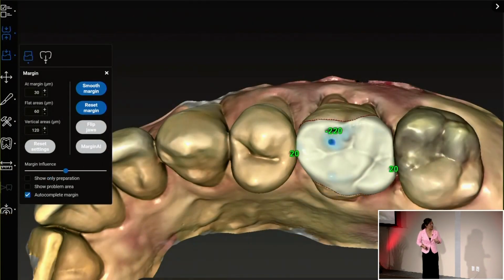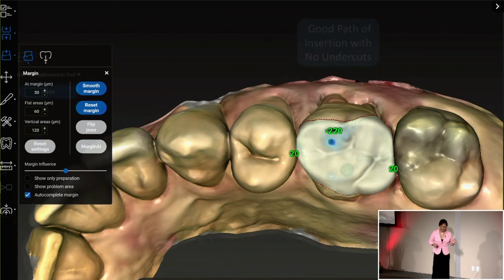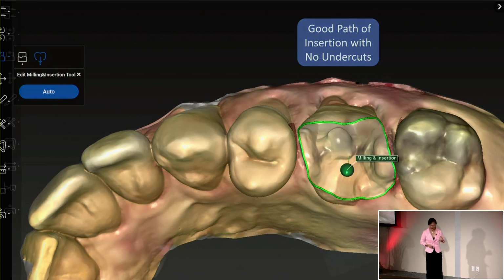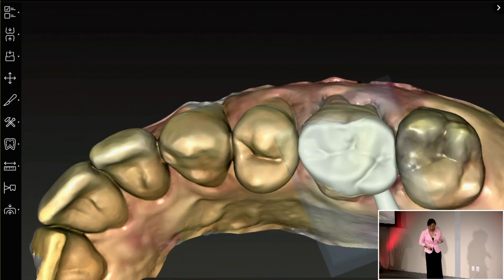And this was the proposal. I didn't have to do much to get a nice design. And I just check my contact parameters. Check that milling and insertion. Very important. And check the sprue. We want to make sure that the sprue is not located in a contact area. Make sure that it's in an area that is not going to cause you to lose your contact.